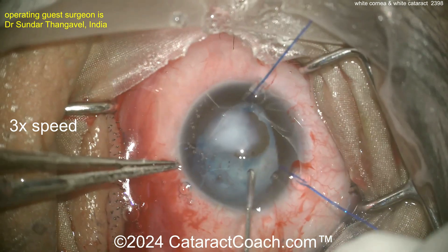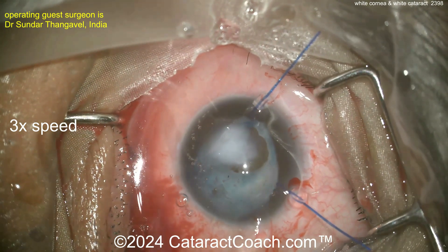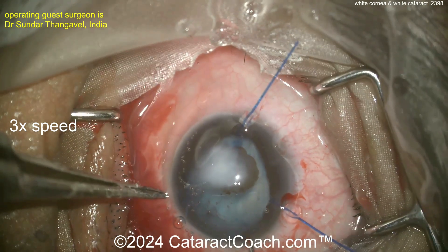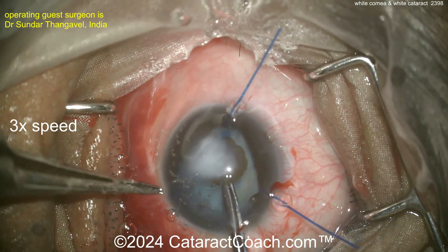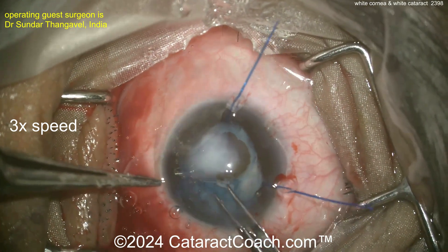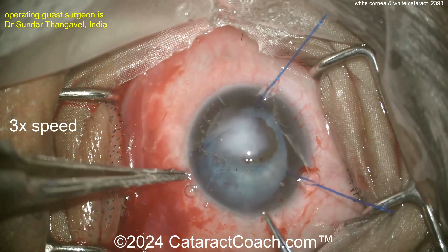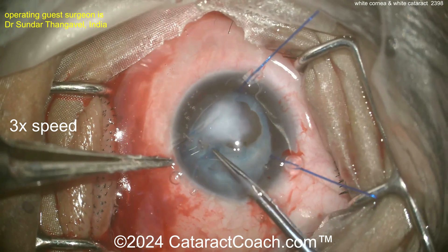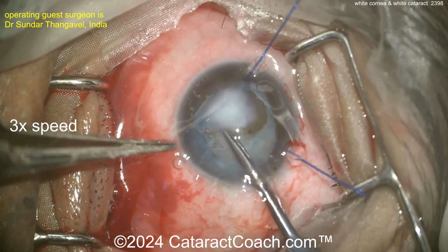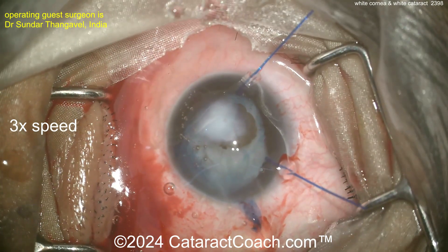Now it becomes tough. Getting this capsulorhexis done is very tough. Here's where an endoilluminator would help — there was a video on CataractCoach about an illuminated chopper, which is like putting a little light pipe in the anterior chamber to get a better view. Here comes the forceps — a little bit of a Jedi mind trick to get it done. You don't have to fully visualize it, but look at that: a capsulorhexis completed. Could you complete a normal capsulorhexis here? That's fantastic.